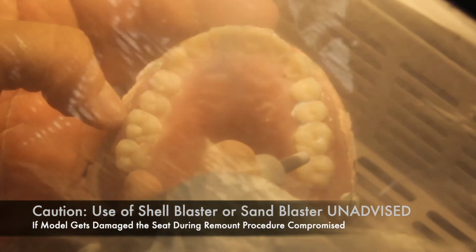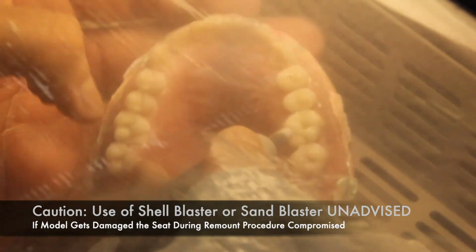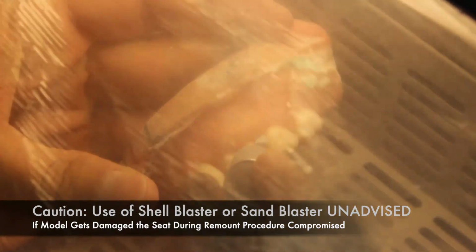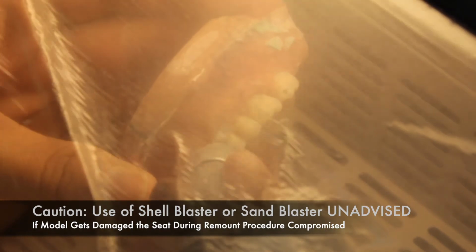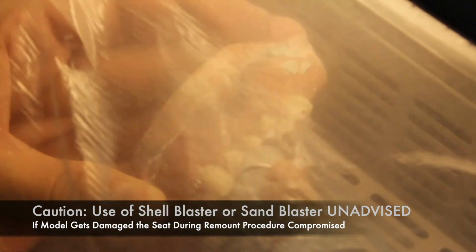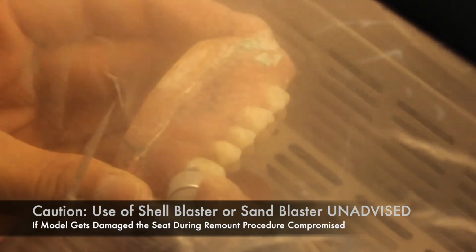According to the Air Force manual, this is ill-advised. The reason being that the sand particles can damage the base of the stone, making it difficult to return to its original articulation. So if a technician decides to use these means, they should proceed with caution.